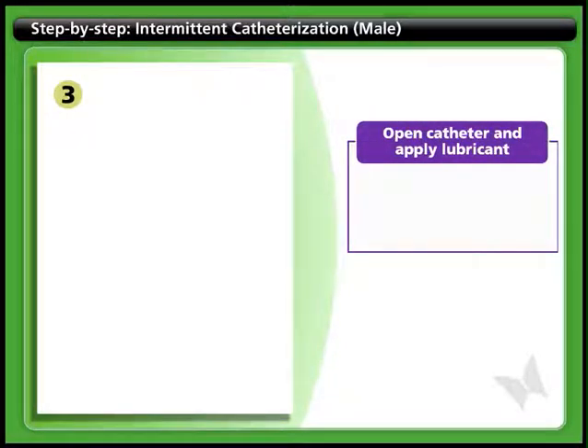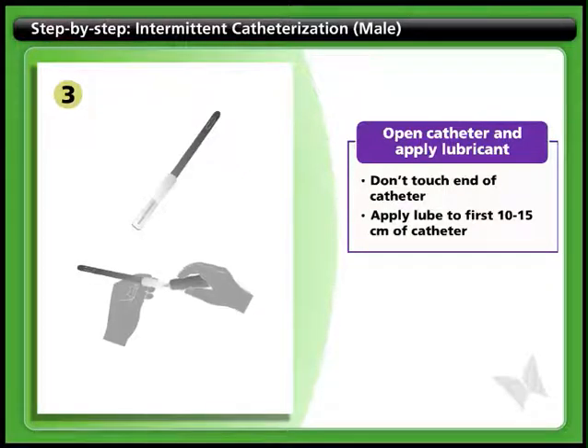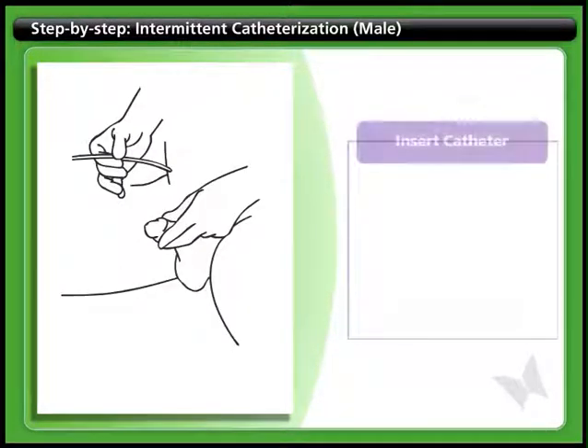Step 3: Open catheter and apply lubricant. Open the catheter package and expose one end of the catheter. Be careful not to let it touch any surrounding items or surfaces. Apply lubricant to the first 10 to 15 centimeters of the catheter.